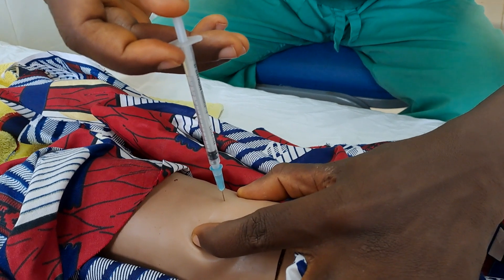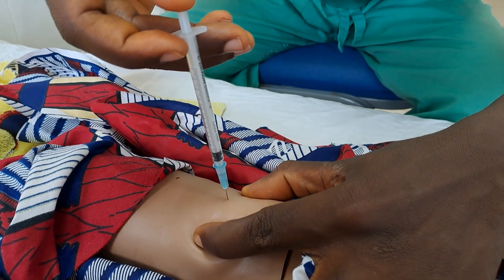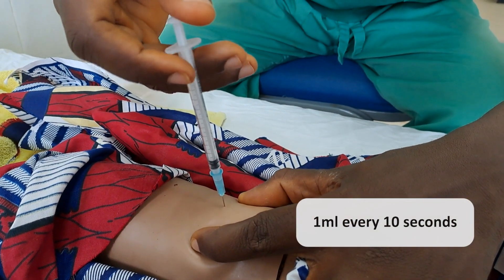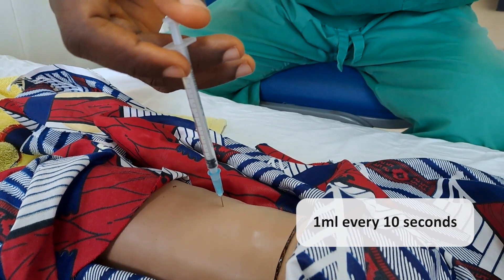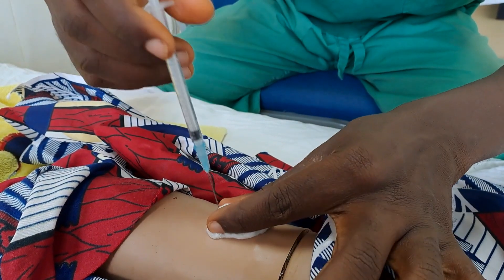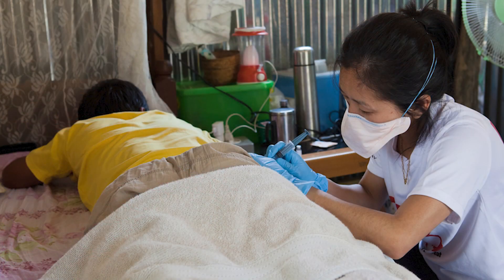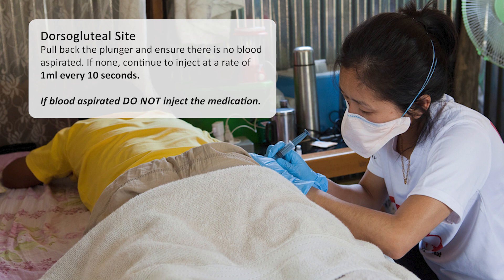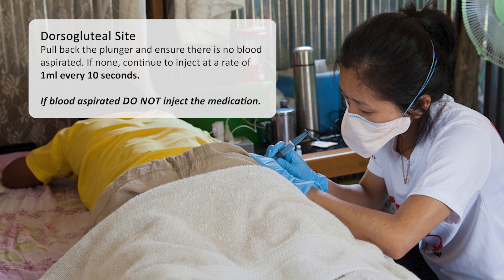For both methods, once the needle is in place, depress the plunger at a rate of one mil every 10 seconds while slowly injecting the medication. If using the dorsal gluteal site, pull back the plunger and ensure there is no blood aspirated. If there is none, continue to inject at a rate of one mil every 10 seconds.